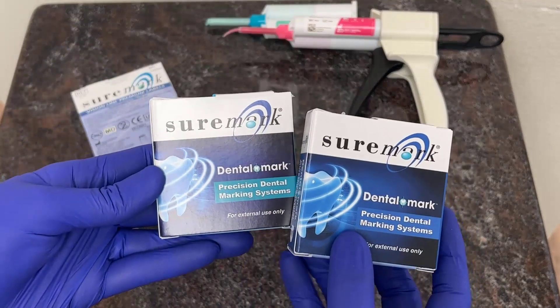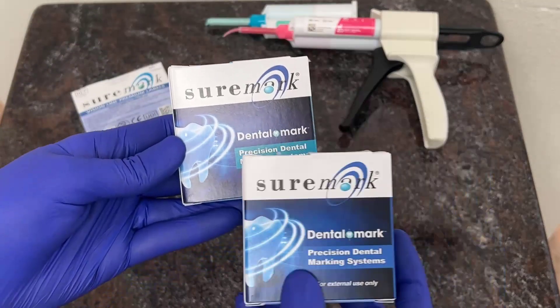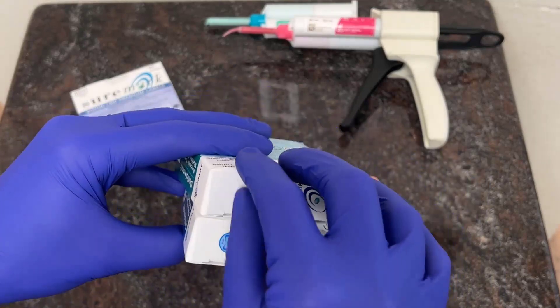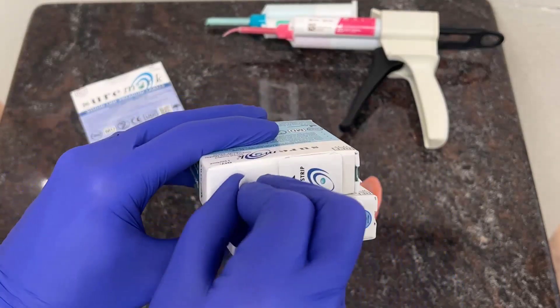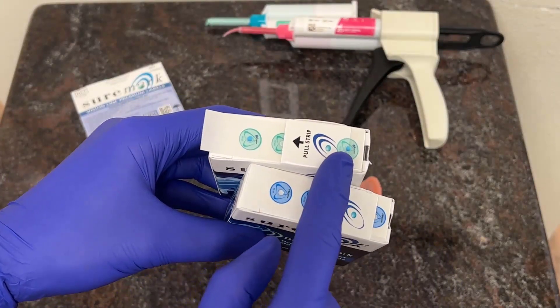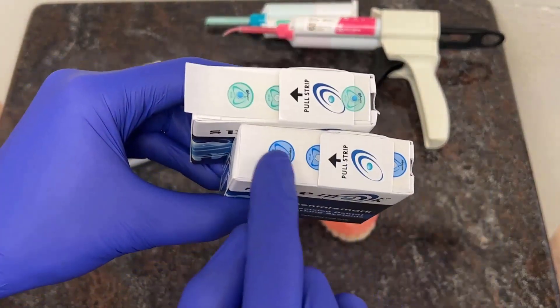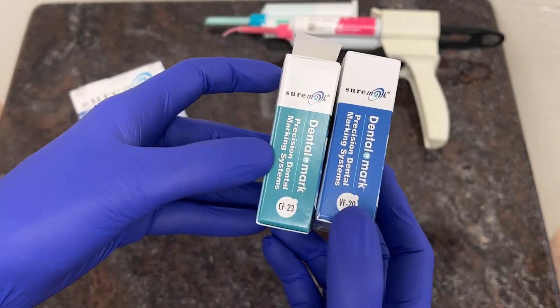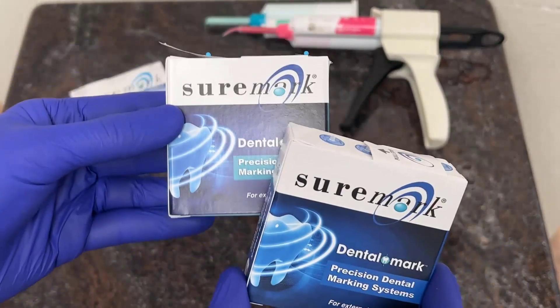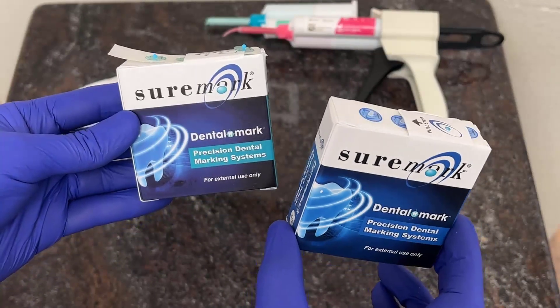They have two different dental mark stickers. The ones meant for dentistry have much smaller stickums. You've got a blue type of ball and a clear type of ball. The clear one is 2mm and the blue one is 2.3mm. Either one of these will work perfectly fine for your Encompass case.